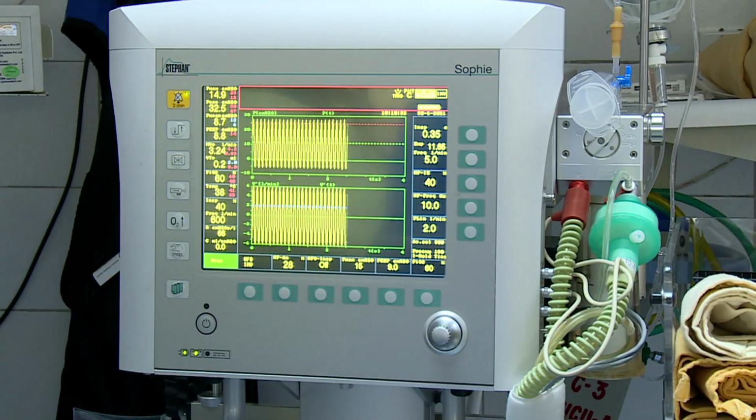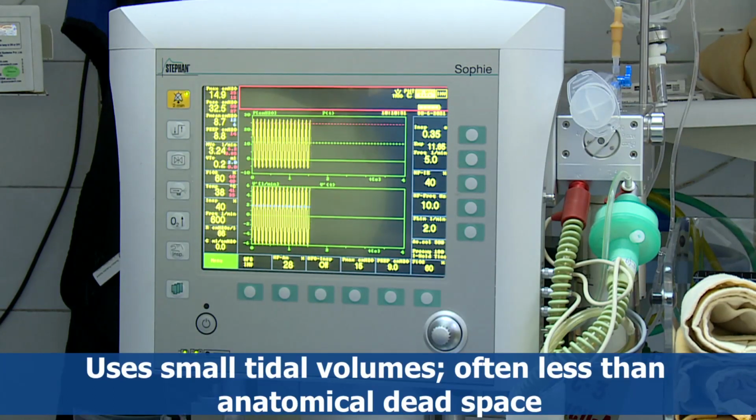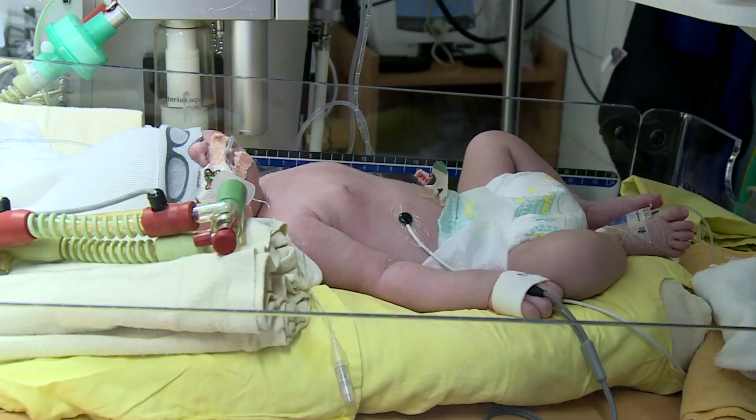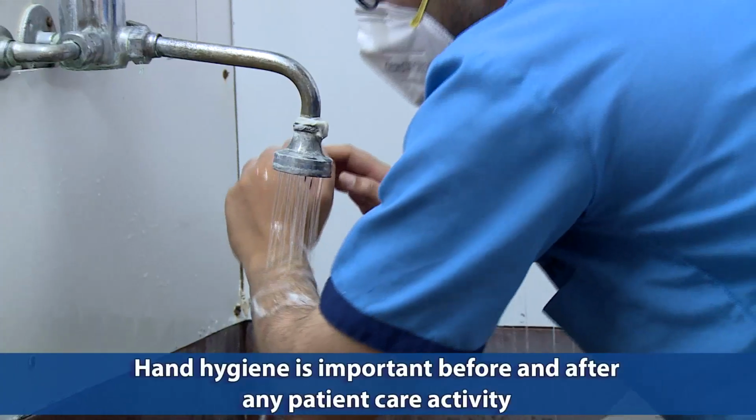High frequency ventilation is an advanced mode of mechanical ventilation that uses small tidal volumes, often less than anatomical dead space, and extremely rapid ventilator rates. In this video, we shall see and learn the care of a neonate while on high frequency ventilation.